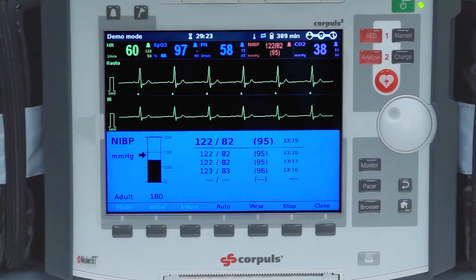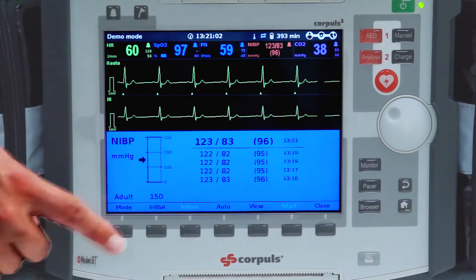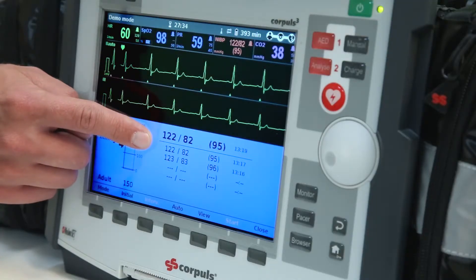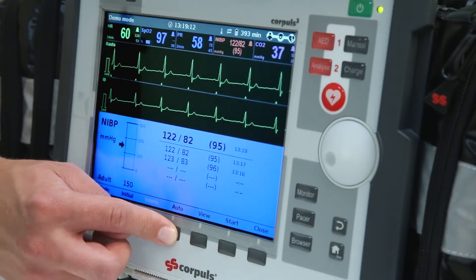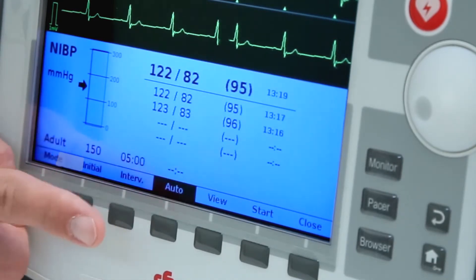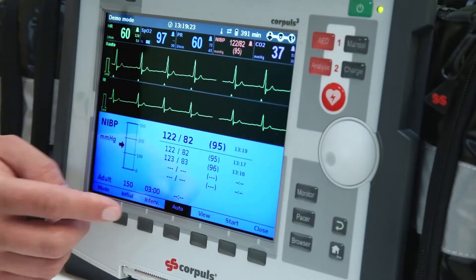After a reading has been taken, the CORPALS 3 will automatically adjust the initial cuff pressure based on the latest measurement. As an option, automatic NIBP measurements can be taken. To do this, press the auto button on the bottom of the screen and the interval button will fade in. To adjust the interval, press the interval key until the desired time is selected before pressing the start key.